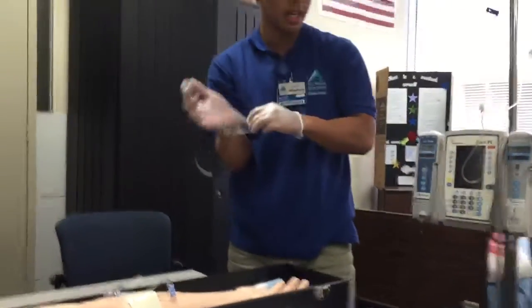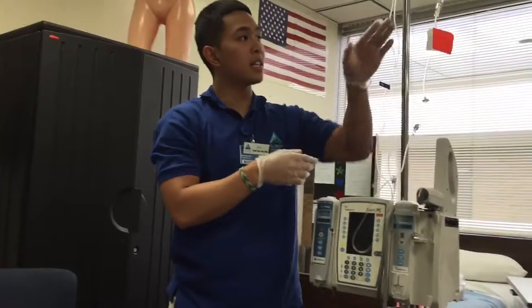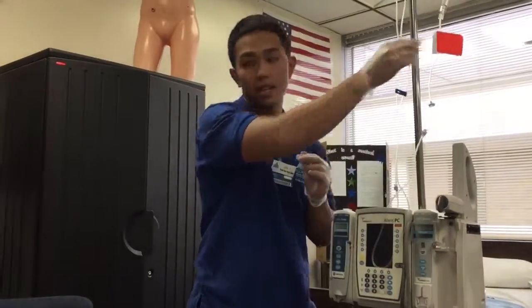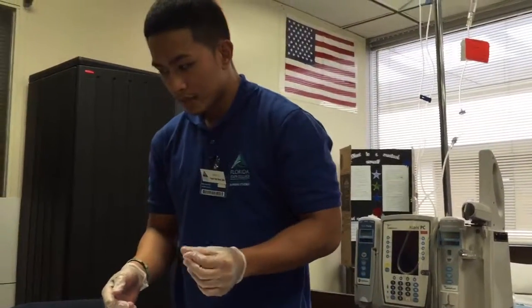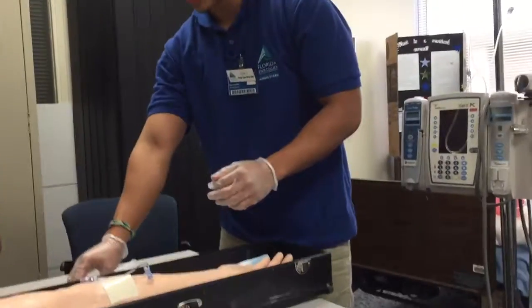So now I can go ahead and start to take this apart. It is already 17 drops per minute that I set the machine to, so that's good. And then make sure there's no infiltration. We're good. I'm going to go ahead and wipe the site.